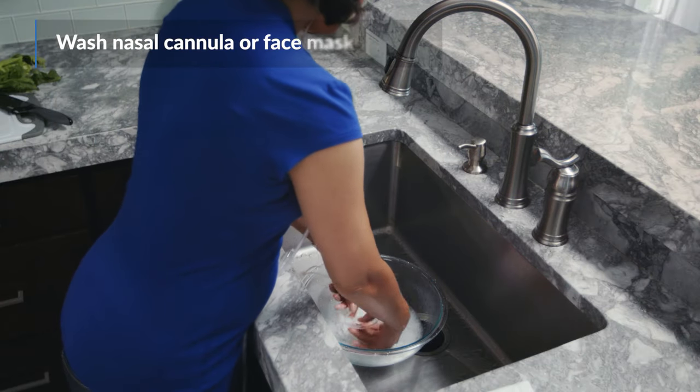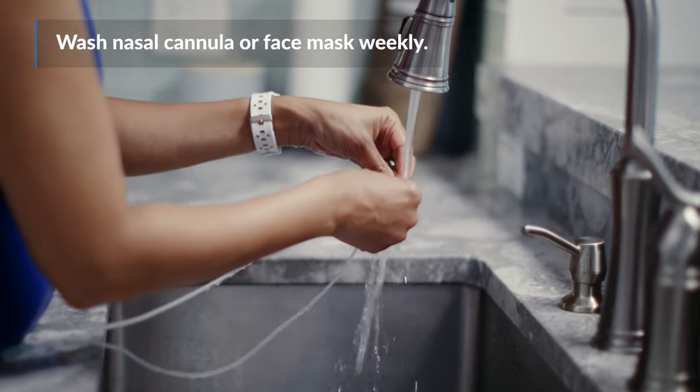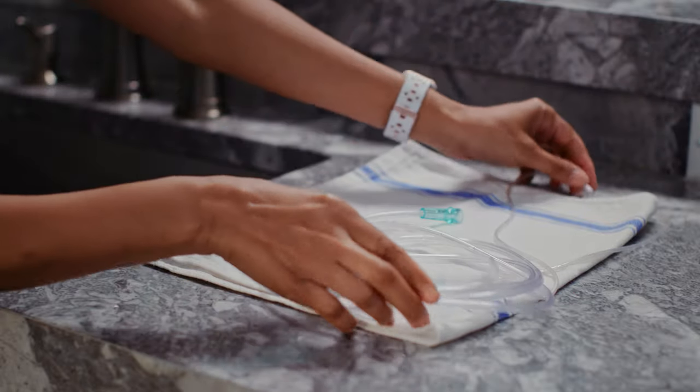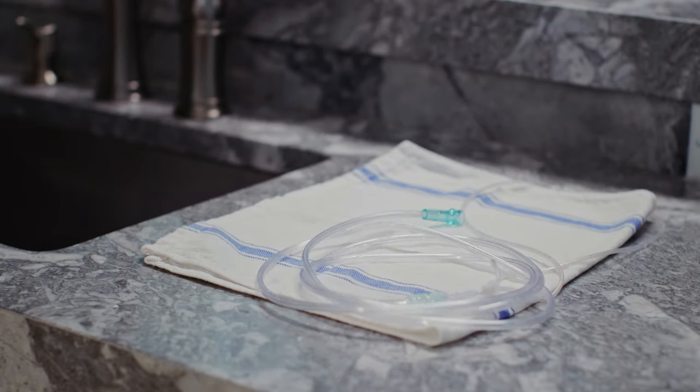Care for your system by washing your nasal cannula or face mask weekly with a mild dish soap and warm water. Clean them more frequently if you're sick and let air dry. Be sure not to get water in the tubing and replace it if it is damaged. You can get replacement tubing from your oxygen supplier.